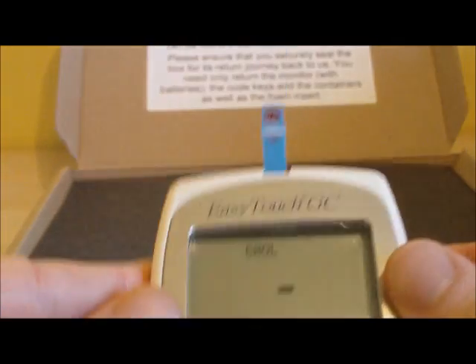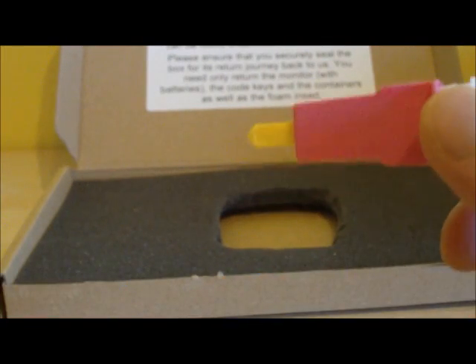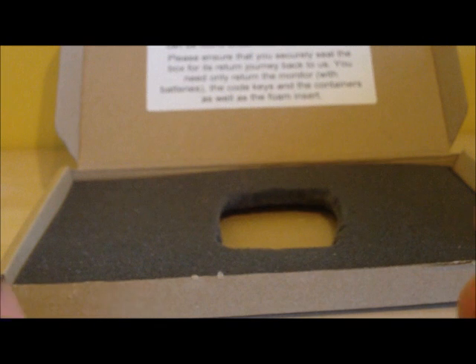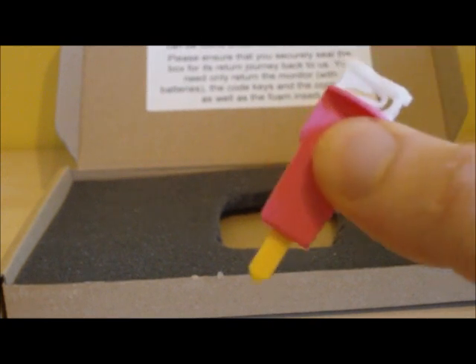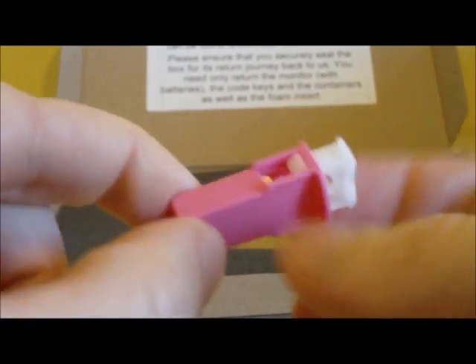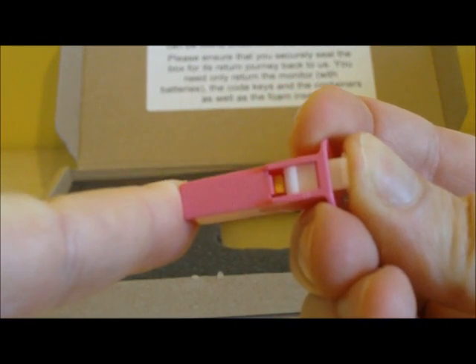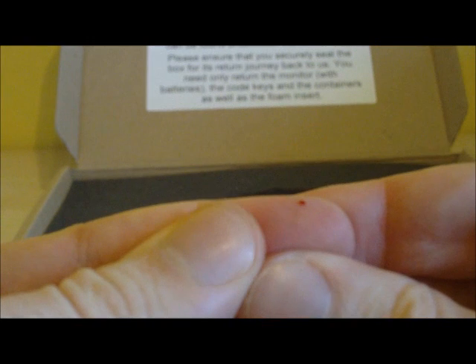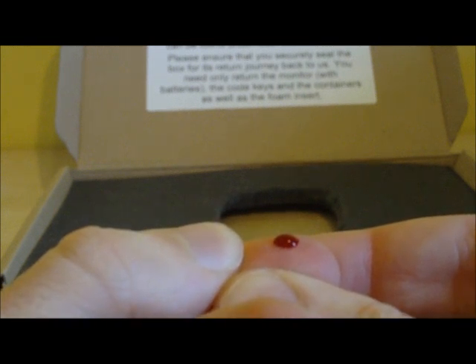Before pricking your finger, go and wash your hands to ensure they are nice and clean, as this reduces the risk of infection. Using nice warm soapy water will also increase blood flow to your fingers, ensuring a good blood supply from the finger prick. Take your lancet, remove the yellow cap, hold the lancet flush with your finger, push down on the white top and you will hear a click. The blood should start forming — try not to squeeze too much and allow it to bleed as naturally as possible.